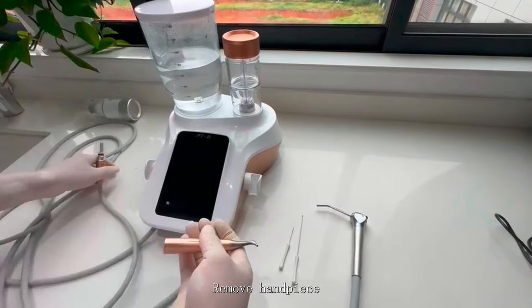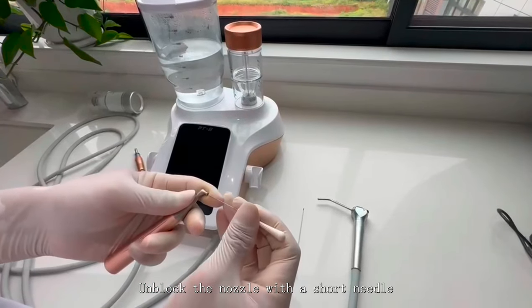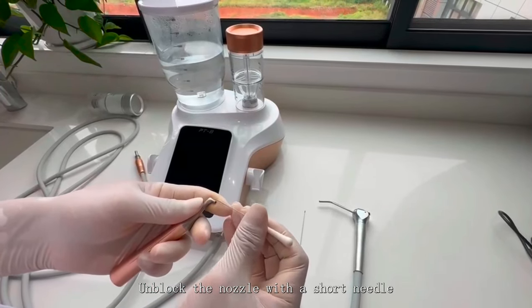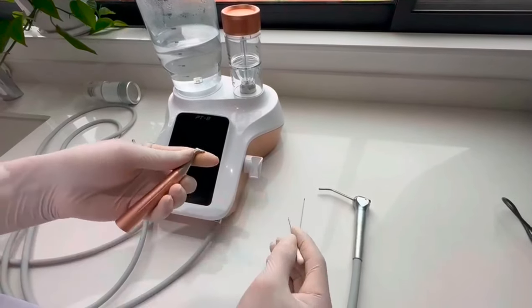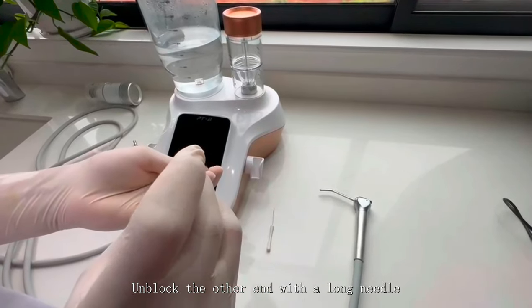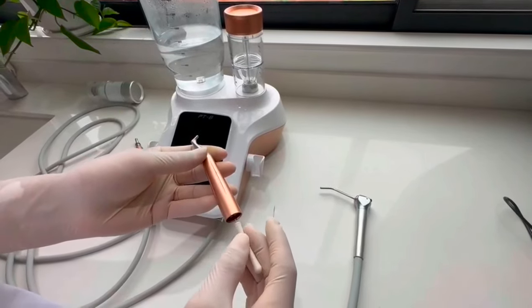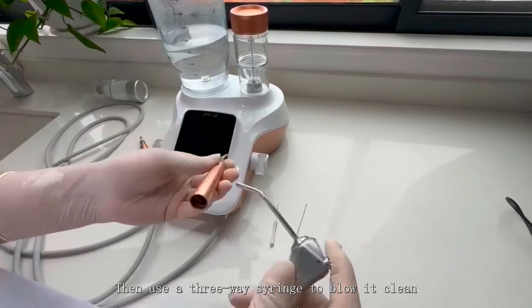Remove the handpiece. Unblock the nozzle with a short needle. Unblock the other end with a long needle. Then use the three-way syringe to blow it clean.